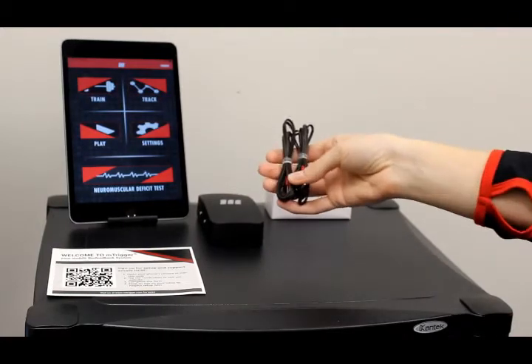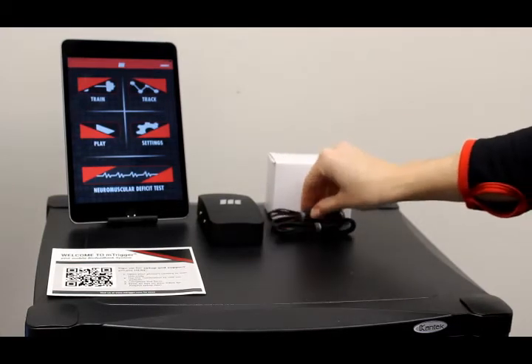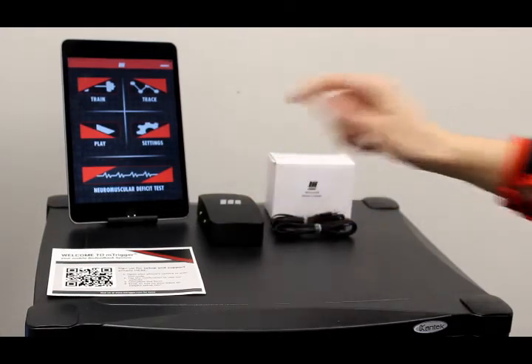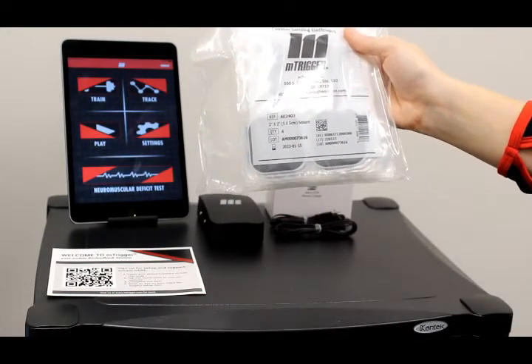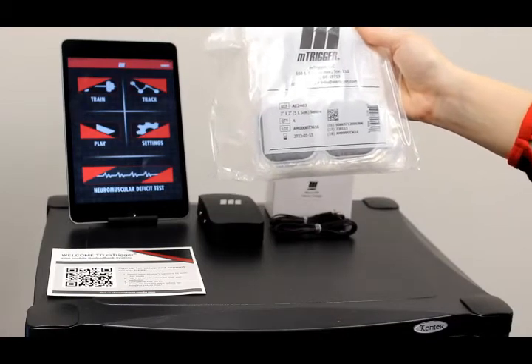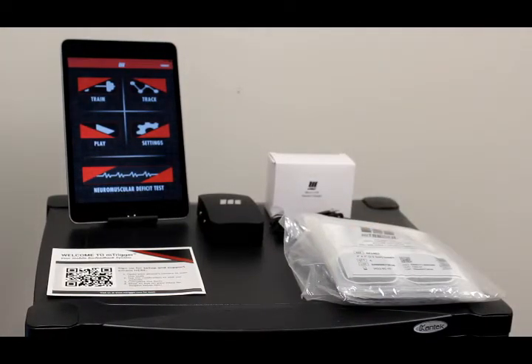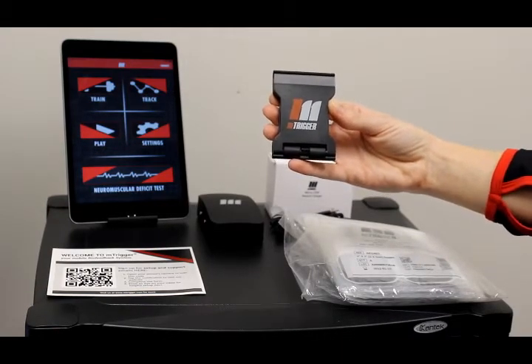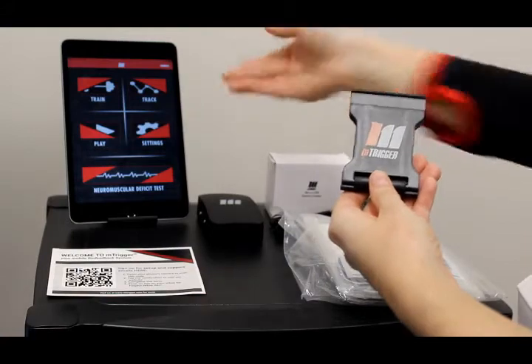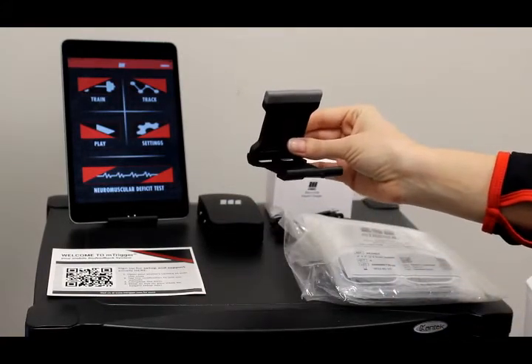Next, you'll find your electrode connector cables. Those are both four feet long and attached to two electrodes each, and then plug into the mTrigger device. Next, you'll find your mTrigger custom sensing electrodes in various quantities depending on your order. And finally, you'll find your mobile device stand. We're actually using one of these right here to prop up the iPad — you simply pop it open for easier viewing of the mobile interface.